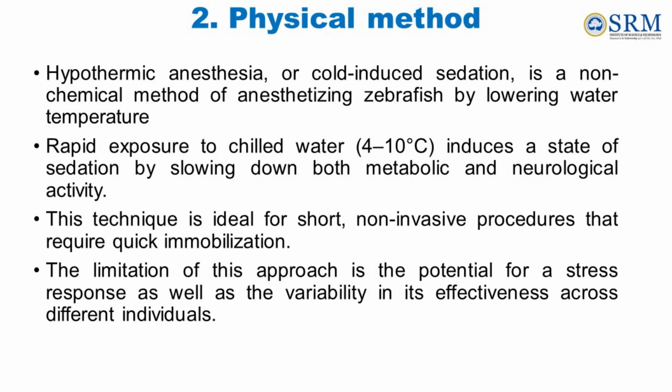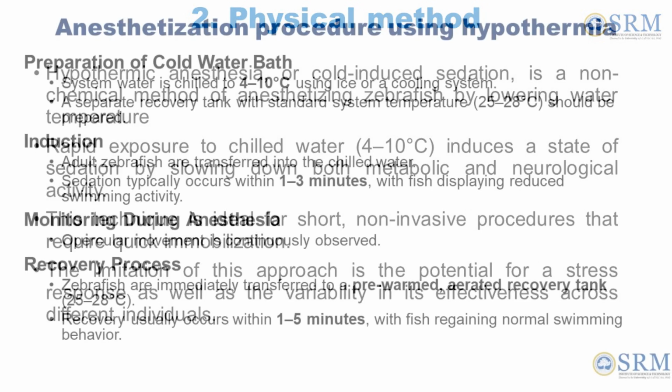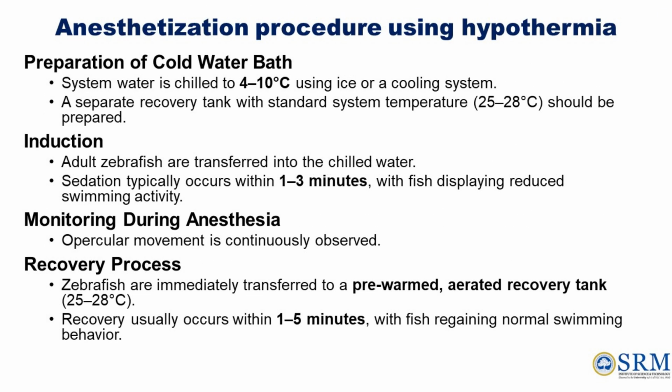The limitation of this approach is the potential for a stress response as well as the variability in its effectiveness across different individuals. Anesthetization procedure using hypothermia involves 4 major steps: preparation of cold water bath, induction, monitoring during anesthesia, recovery process.